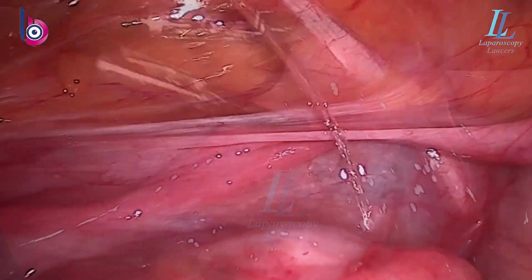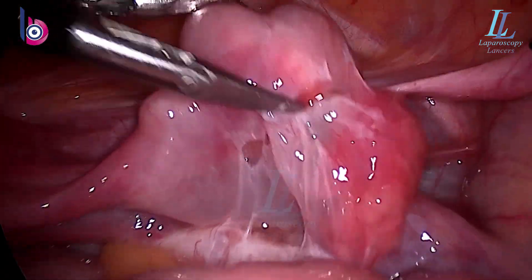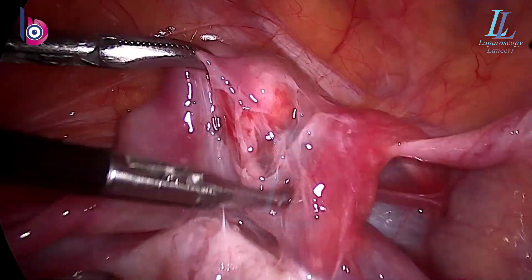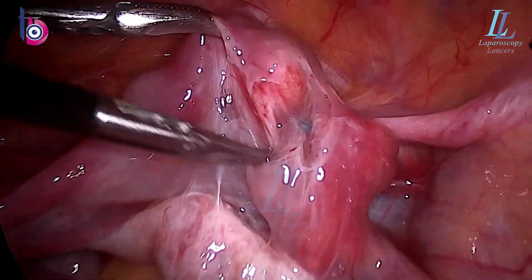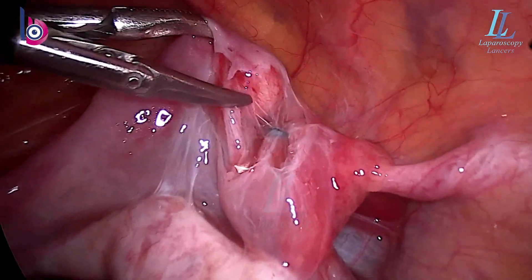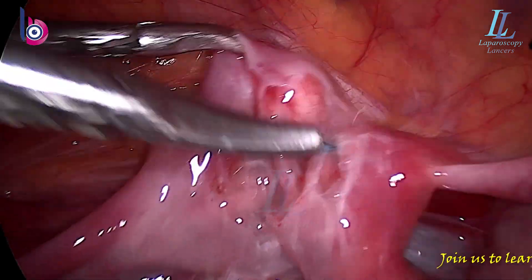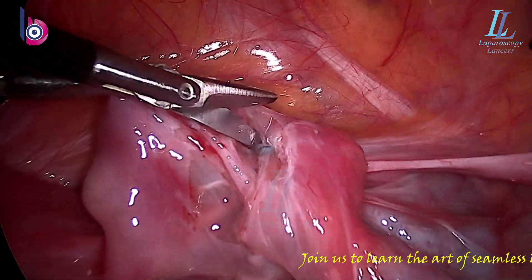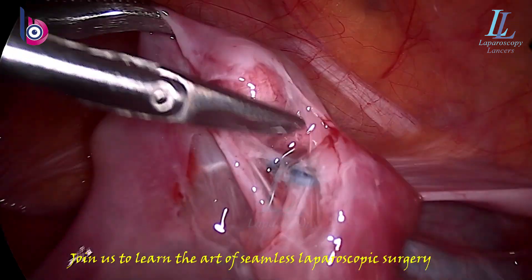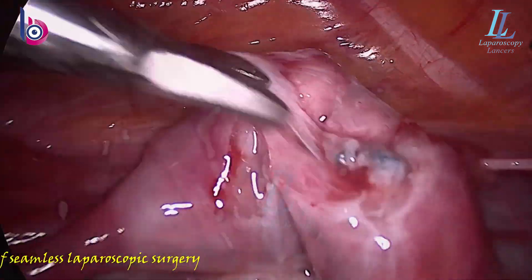Vasopressin injection in the mesosalpinx devascularizes it — 20 units in 100 ml of normal saline — and the dissection begins. Look at the amount of adhesions being encountered. We can see some suture near the fimbrial end. I don't know who did this surgery and why they chose to ligate the tubes near the fimbrial end. Though the chances of success in this case are almost nil, as we are already inside we have to complete this surgery.